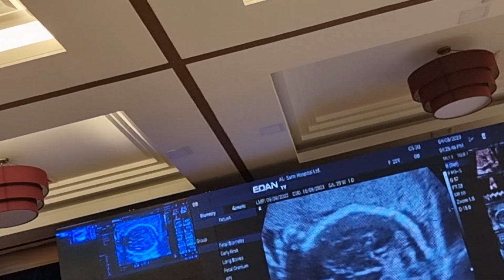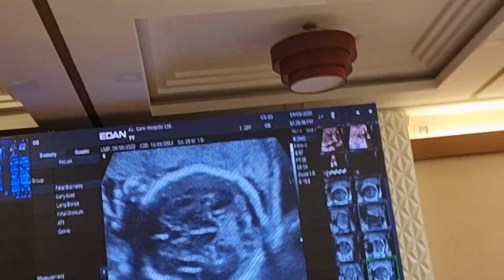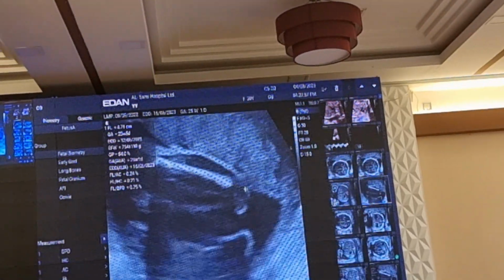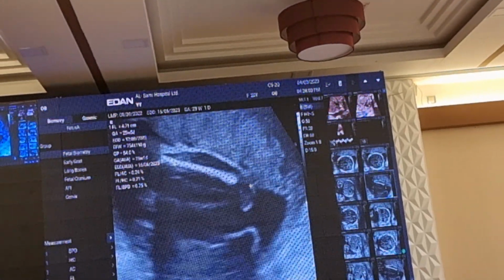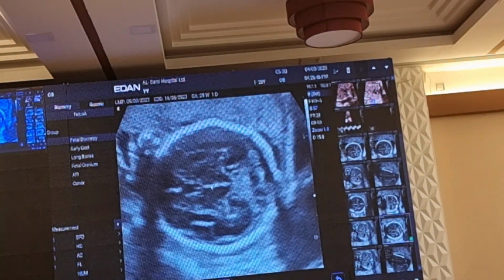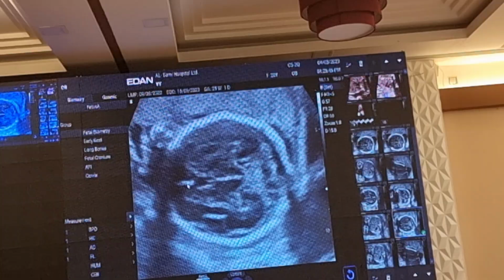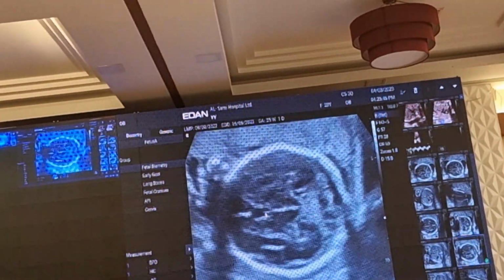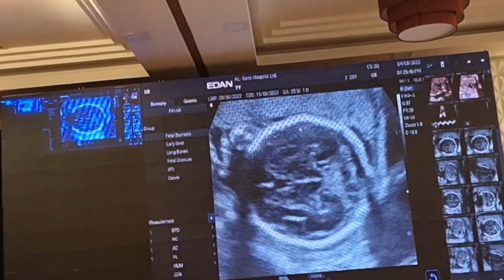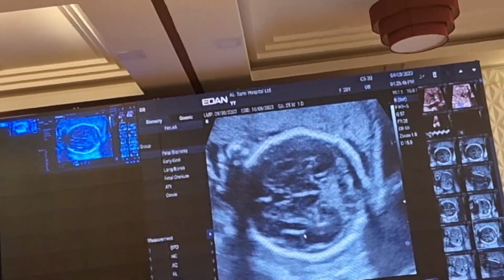So when we do look at a fetal brain, we have three important planes. This is known as the basic exam. So we have a transthalamic plane, and in this plane, the important structures are the interhemispheric fissure, the CSP or cavum septum pellucidum, and then of course we have the thalamus, and this we typically use for measurement of biometry. A very important structure in this is the lateral sulcus or the Sylvian fissure.